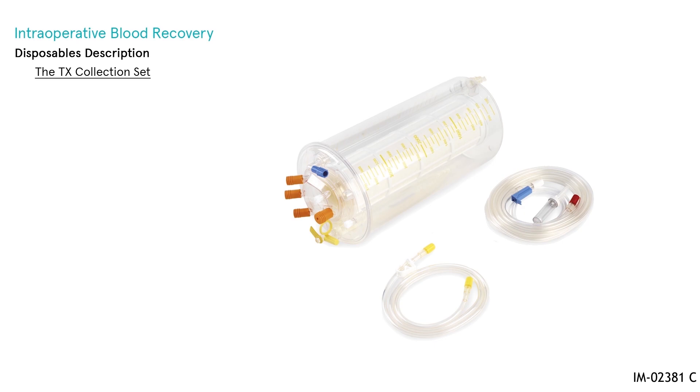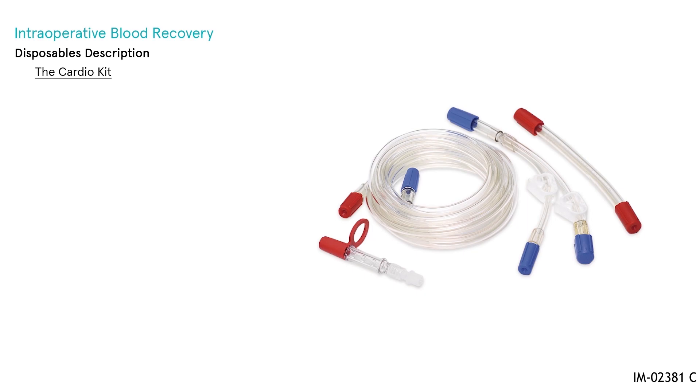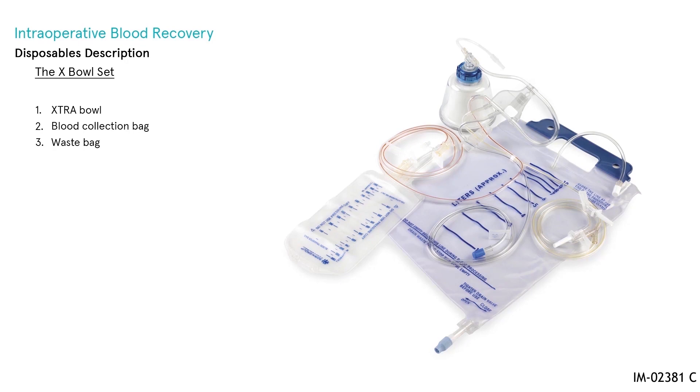The TX collection set is a top configuration and contains the X-Res T collection reservoir, the aspiration and anticoagulation line, and the vacuum line. The Cardio Kit contains various adapters and tubing choices that can be used to add or modify existing disposables for unique uses, such as quality control sampling or connection to an oxygenator.